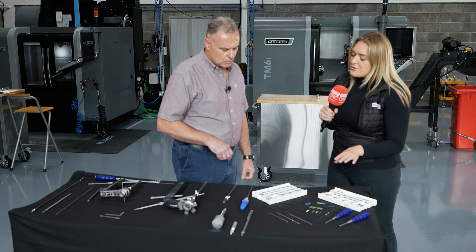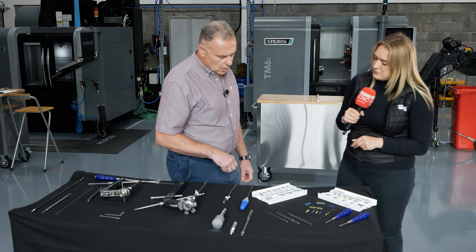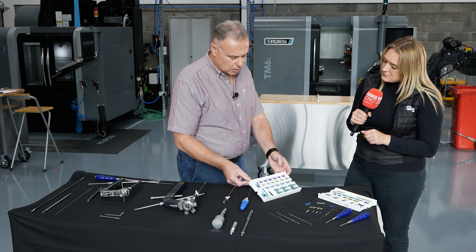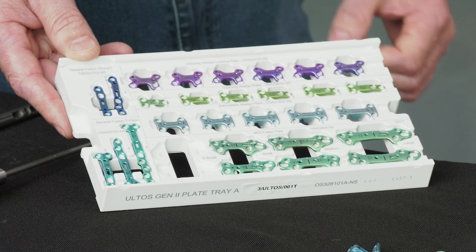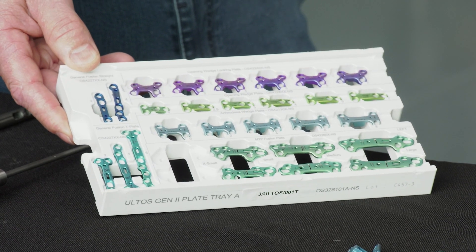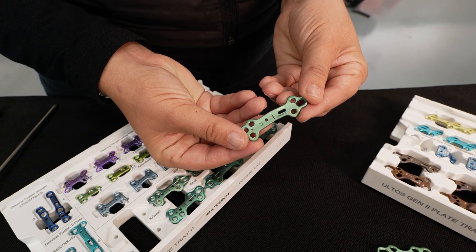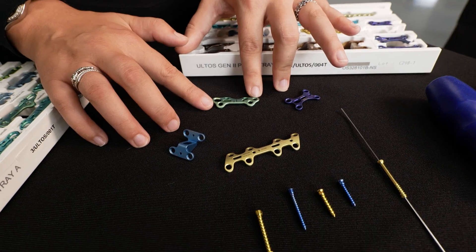We've got this Meccano-looking set here Kevin — what are these used for? Basically they're used for various types of procedure within the foot. It could be for fractured joints within the foot or for realignment of specific joints.